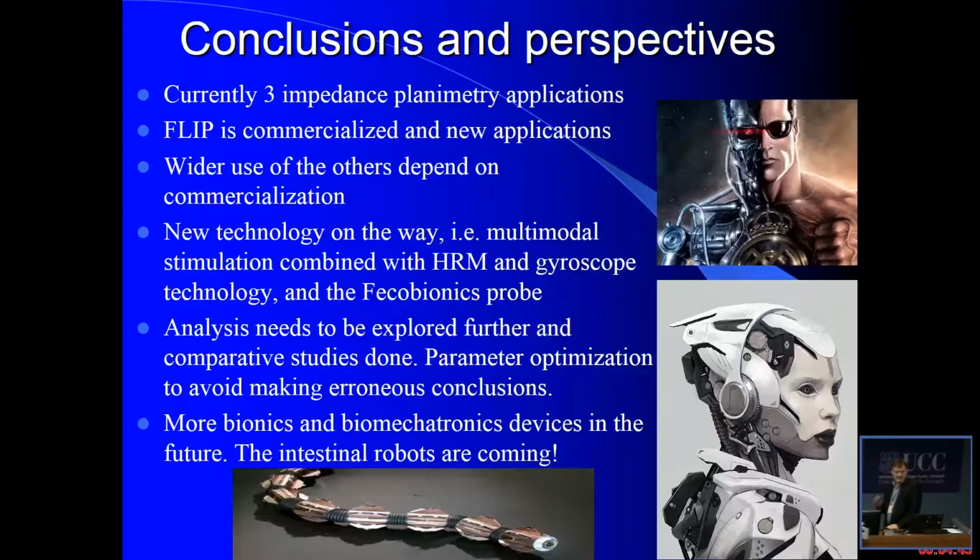There are several groups working on intestinal robots that can crawl around in the colon, probably also in the small intestine, do measurements, send data out. So I think this is really where we will see a lot of development, and I would be happy if we would see impedance planimetry and pressure profiling built into that kind of systems.